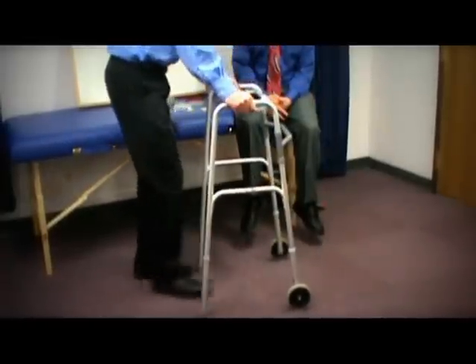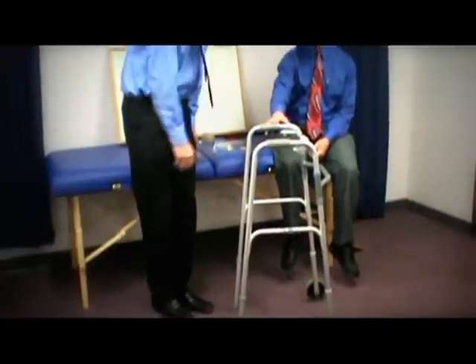Another thing is, if you have a back problem, you have to lift that walker up every step. It's common that the back will be irritated, so the wheels eliminate that. And you're putting more stress on your joints because you're picking it up and having to lift something. By far these are probably the most popular walkers out there.